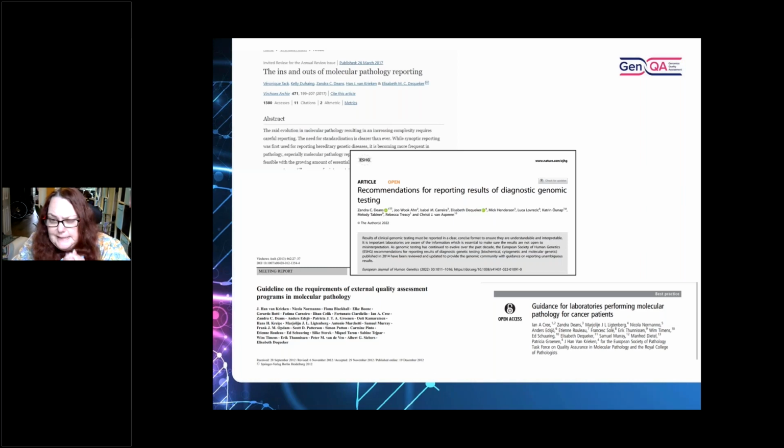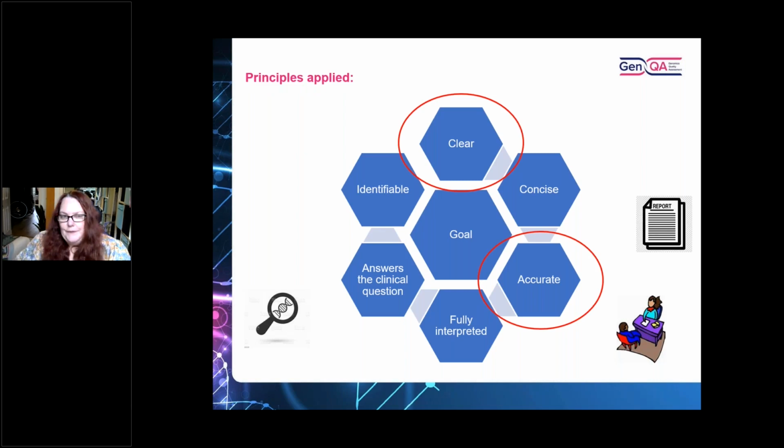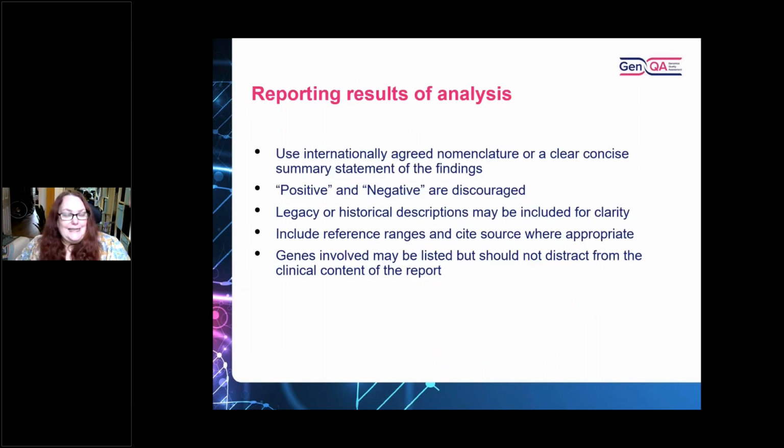So next slide, please. The principles that apply to reporting, as outlined in that document, are that it should be a clear report, you should be able to identify the patient, it should be concise, accurate, answer the clinical question, and be as fully interpreted as is appropriate. So next slide. And I'm going to talk about how a report can be clear and accurate. And on the next slide, you need to use internationally agreed nomenclature or a concise statement to give a result of a report.